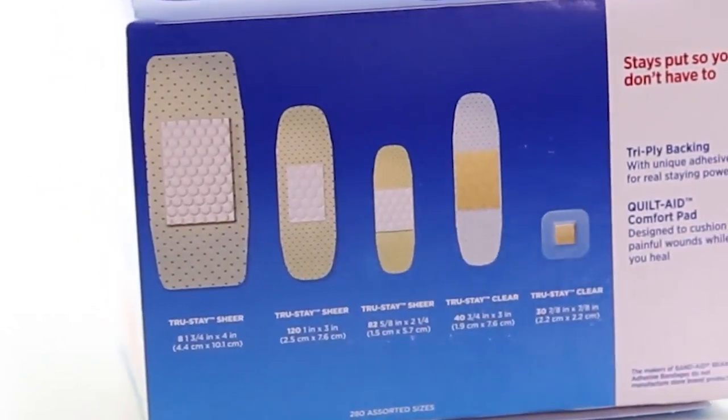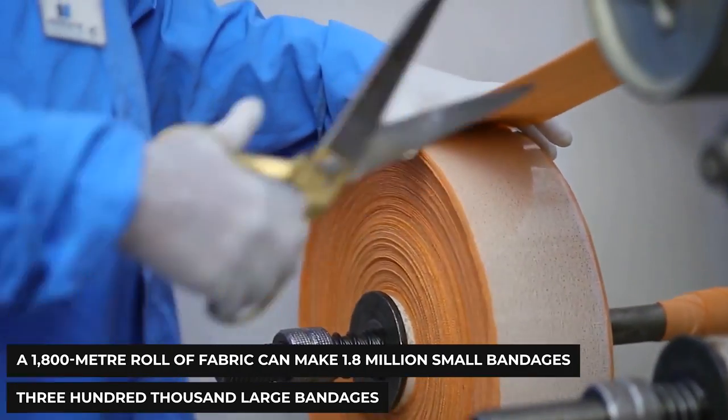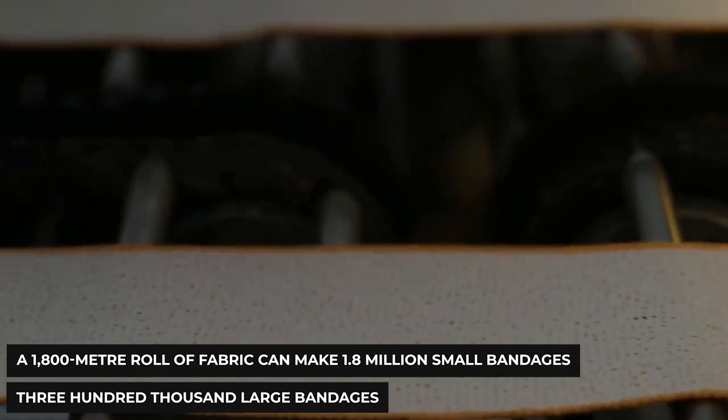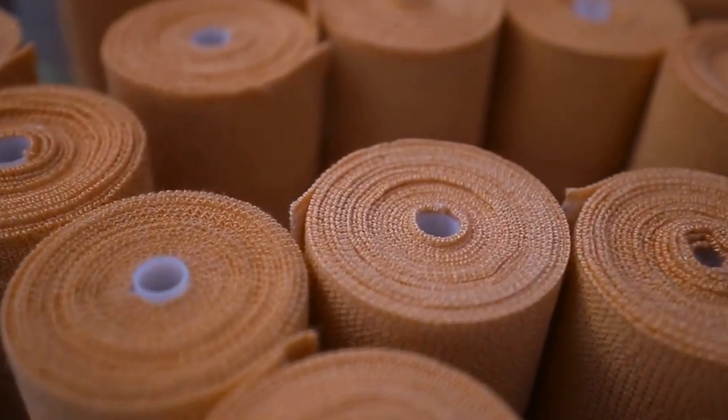This is a truly fascinating process. For example, if we take a 1,800-meter roll of fabric, it can make 1.8 million small bandages and 300,000 large bandages. And with that, moving on, it's time to bring adhesives into the mix.